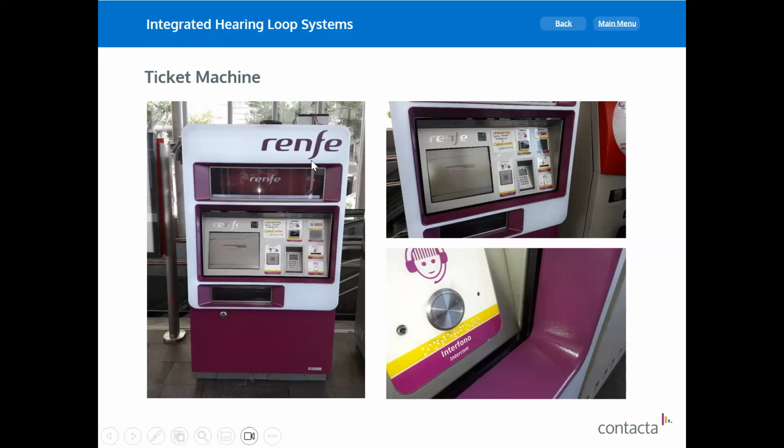And it gives a strong signal, at least 3 feet of projection when you're standing in front of it. And the driver, the audio source and power, it's all internal inside the machine. Again, not a problem because the machine already has power, it already has the audio. So I'm just taking a feed from that and finding the right place for the loop aerial. So the challenge with this installation was to put the loop aerial outside in a place where it can be effective.